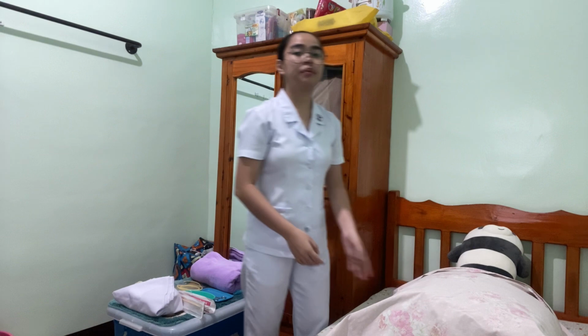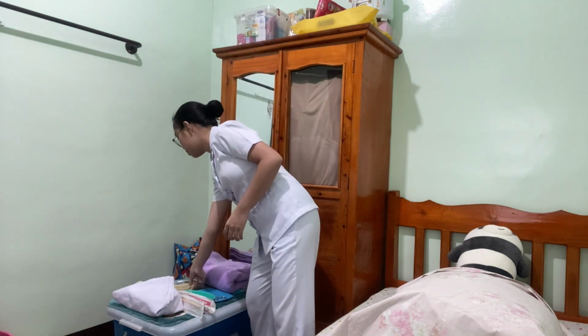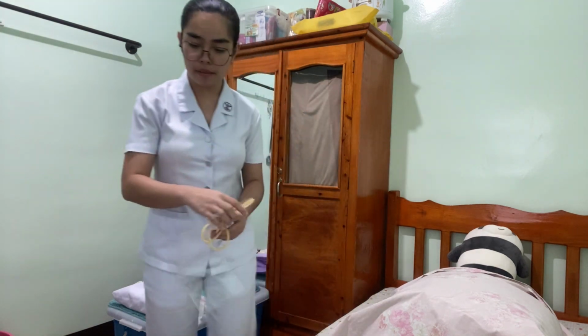Okay. So the next thing that I'm going to do is to secure the urinary bag on the patient's bed frame. So the urinary bag should be below the waist level of the patient. So I'm going to put the urinary bag here.